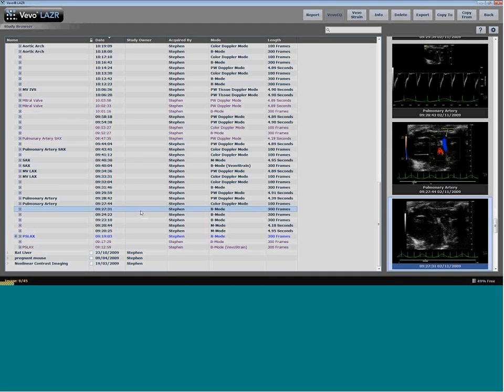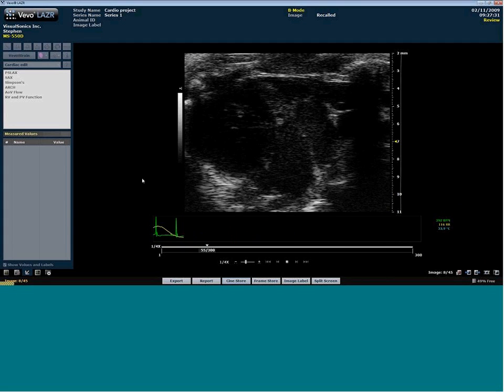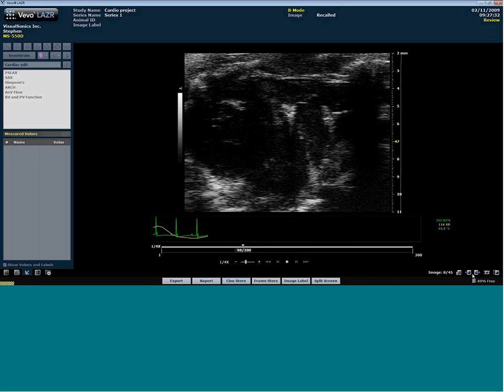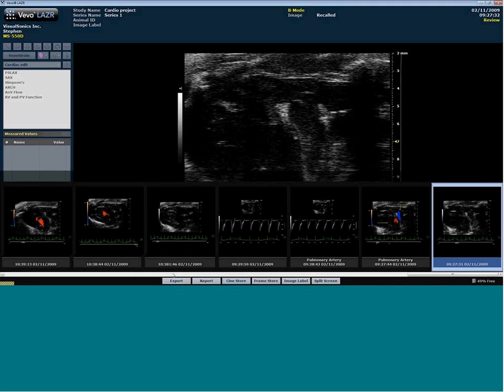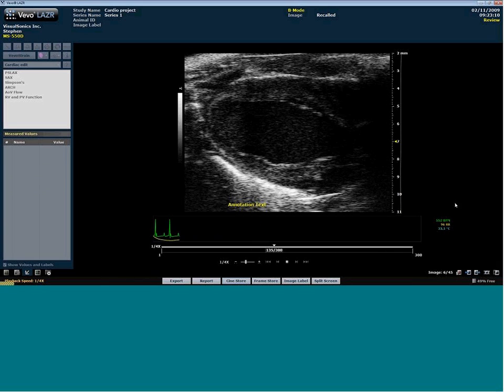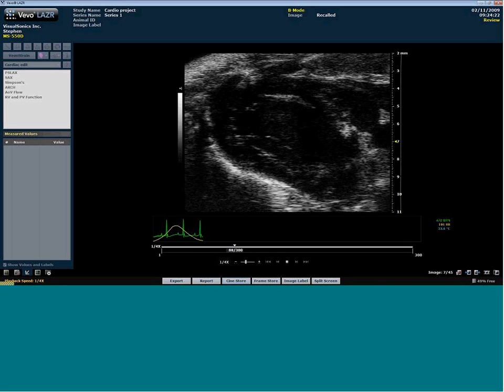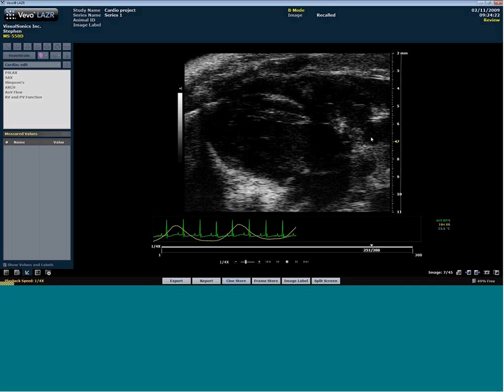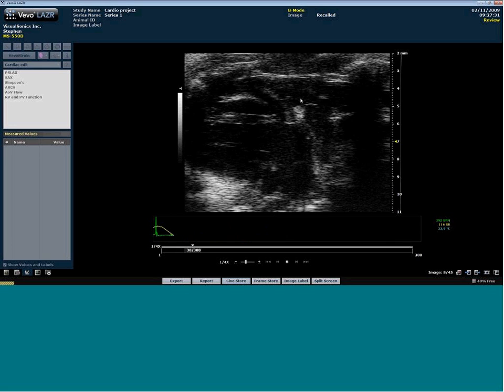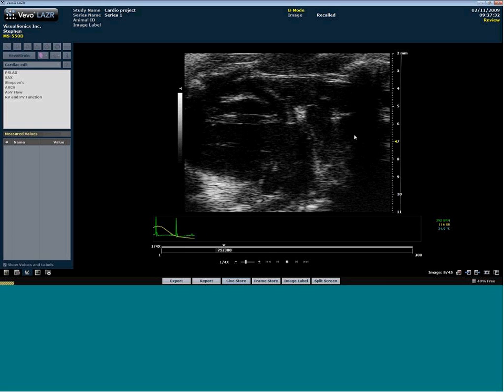I do have pulmonary. I've got some good pulmonary images here. So these are just ones that I took off of a normal animal here at the lab. So this is just a B-mode. You can actually see the progression. If we go back to the long axis, which is about here, you can see the progression of going from long axis up slightly towards the aorta, and then tweaking the plane of view slightly here to get the pulmonary. So this is the pulmonary flow here. The aortic outflow tract here, and on the other side.